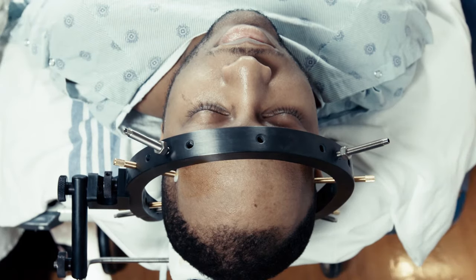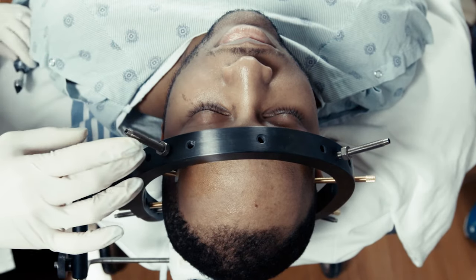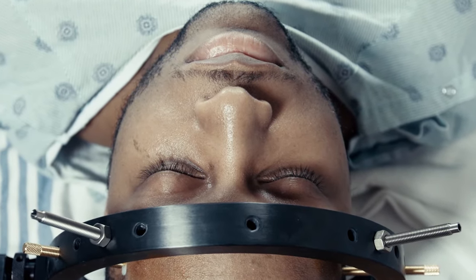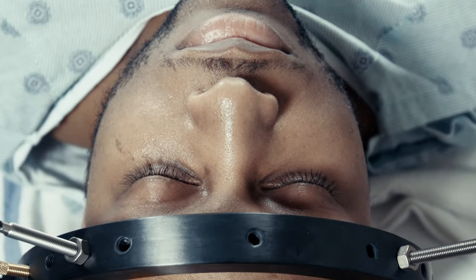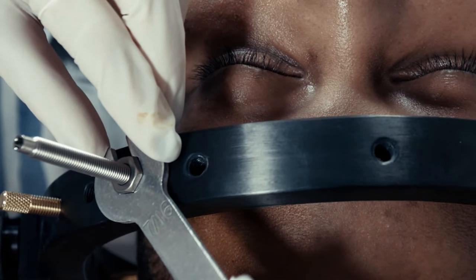Torque pressure may need to be lessened for elderly and pediatric patient populations. Higher pressure may be used for a larger patient. Care should be taken to hold the eyelids closed while tightening the anterior pins. Failure to do so may result in a pulling sensation on the eyelids. Finally, locking nuts are placed over the pins and tightened securely to the ring.